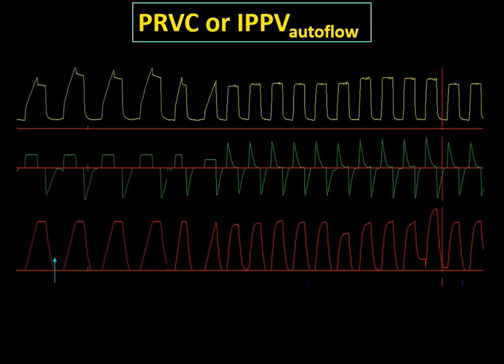which is a way by which, sorry, it's a little bit dark, but basically here, if the mechanical properties of the respiratory system change, this is volume control ventilation, you see that, as I described before, plateau pressure will change. Now we switch to these hybrid modes, and basically the ventilator is working in a pressure cycled mode, but it is adapting the inspiratory pressure at every breath in order to deliver the tidal volume which we have set as our target.